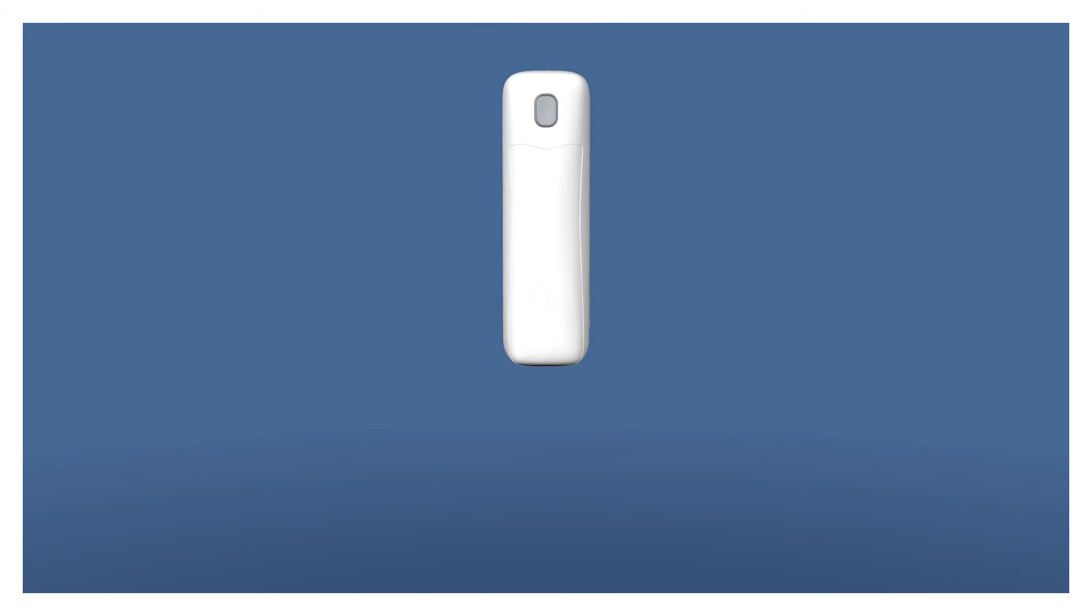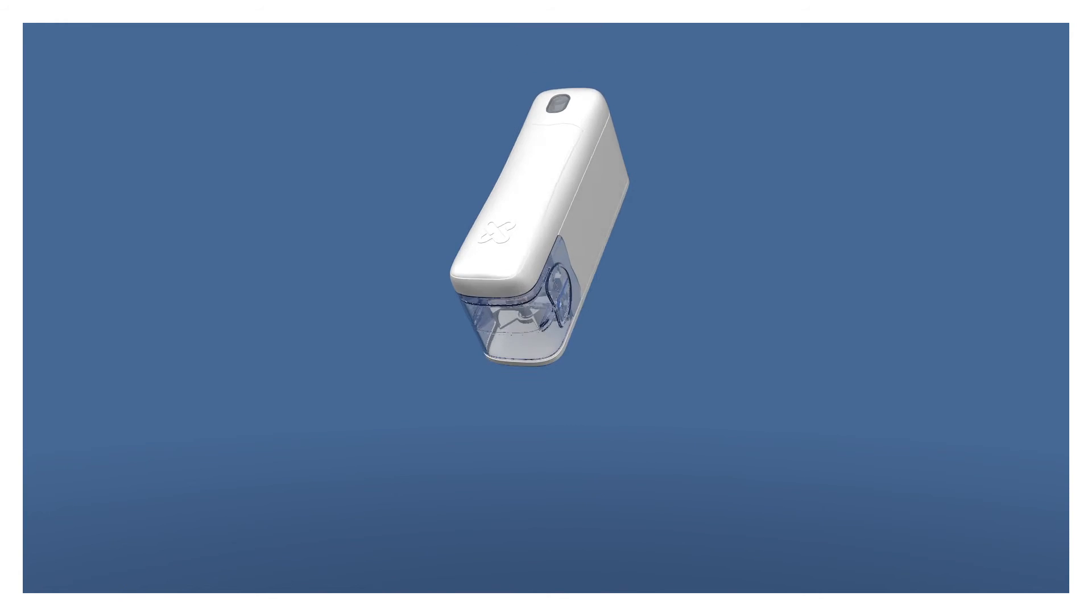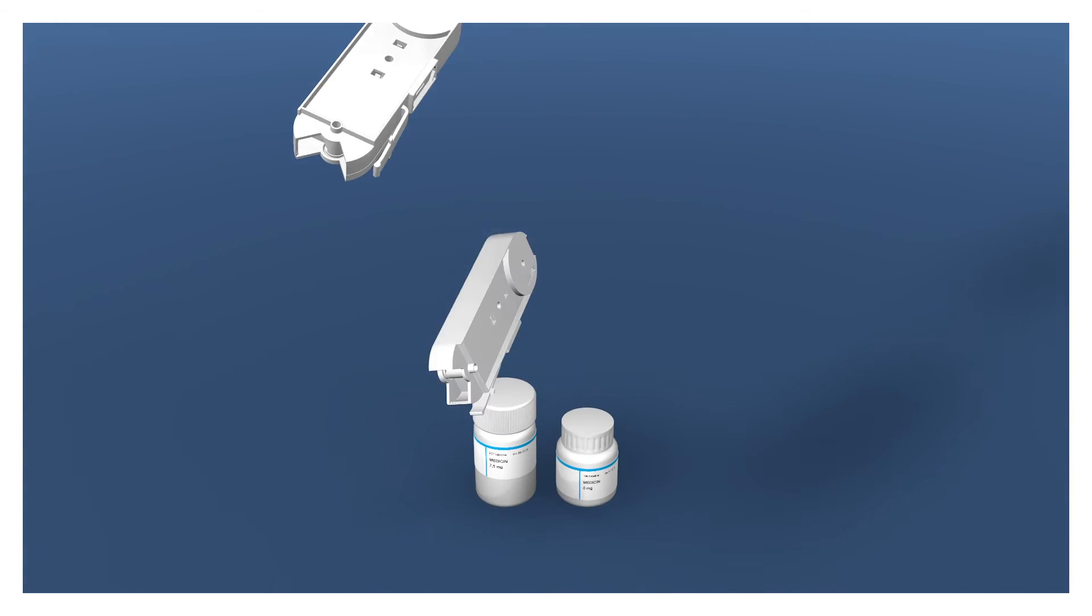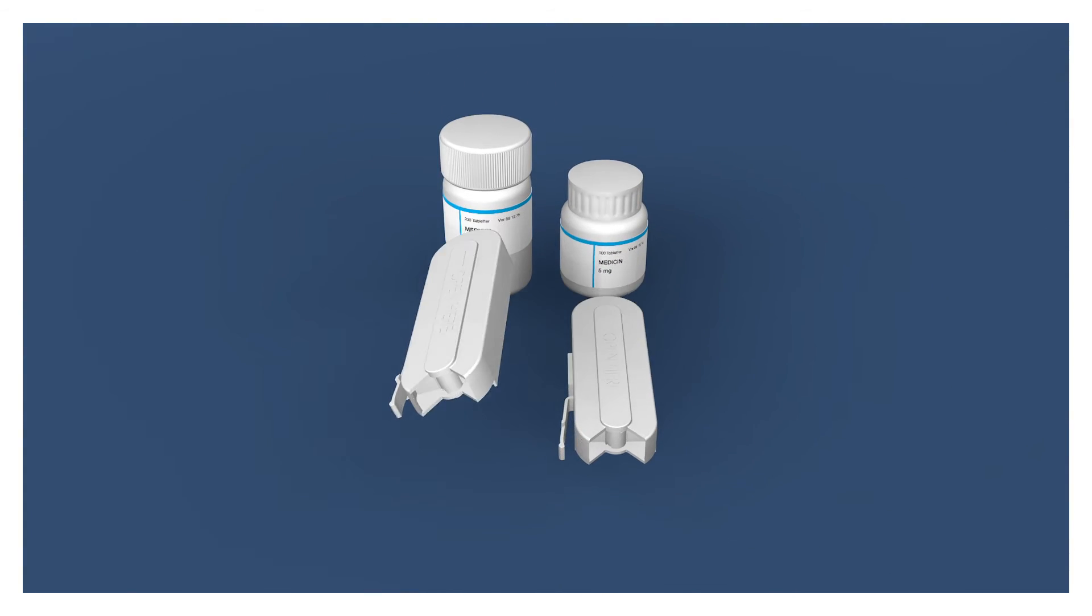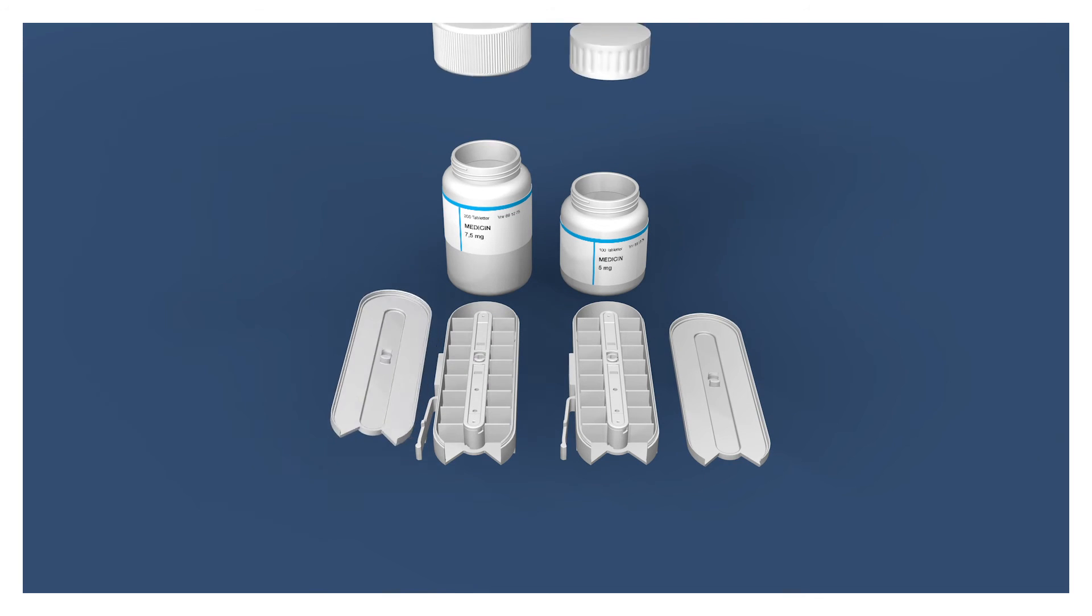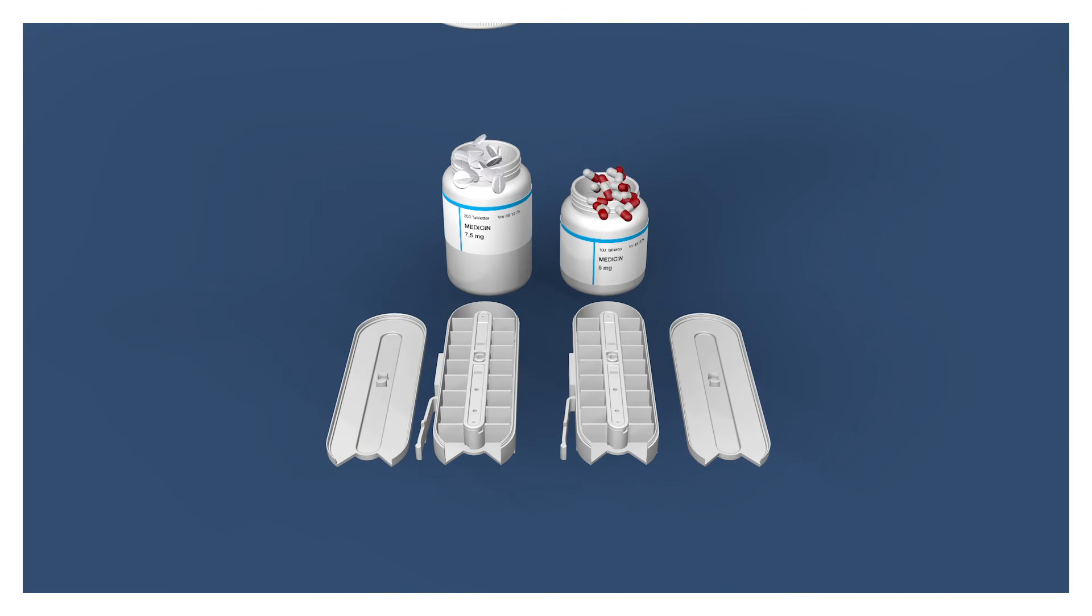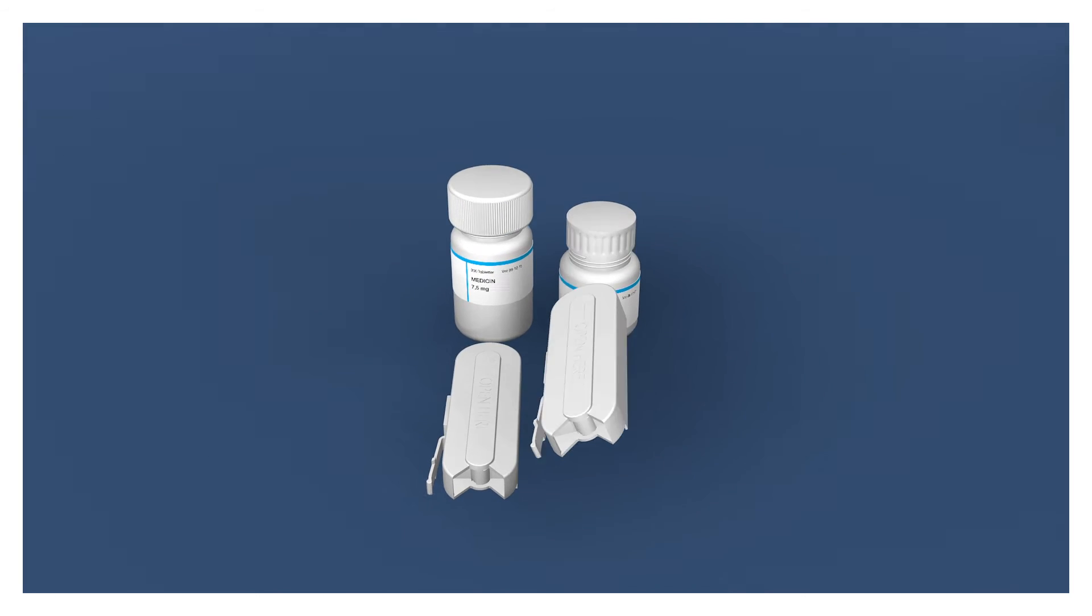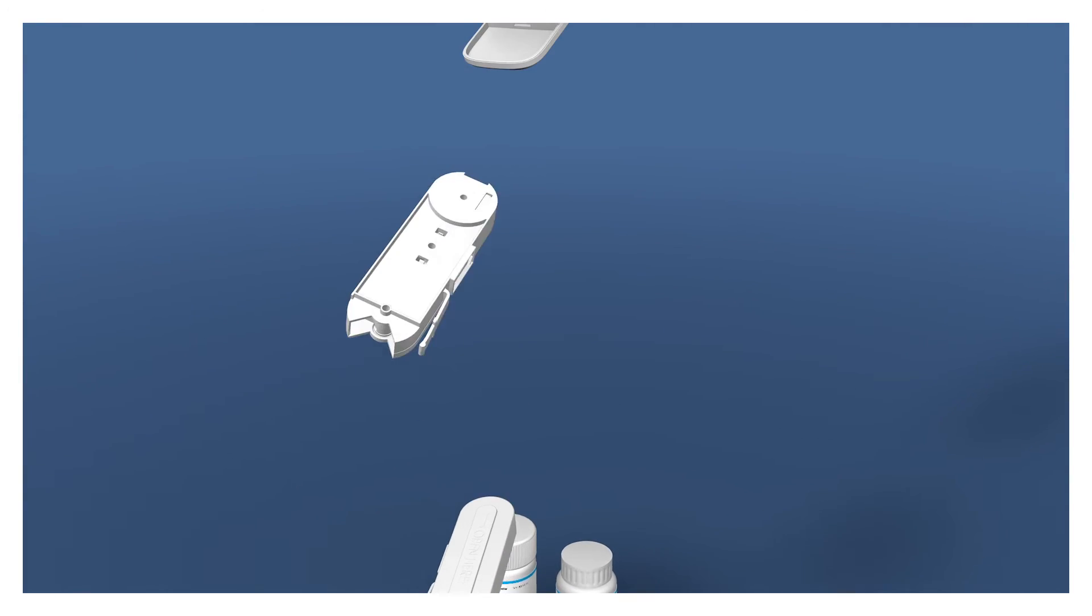In Medimi, all pills are separated until the time of taking the medicine, which makes filling easier and minimizes the risk of interaction between different substances.